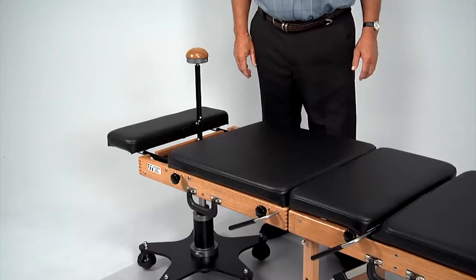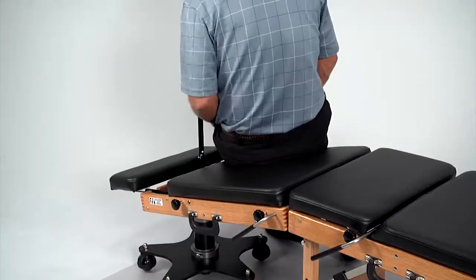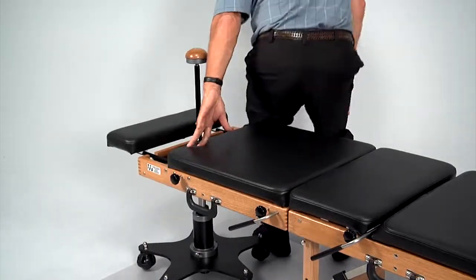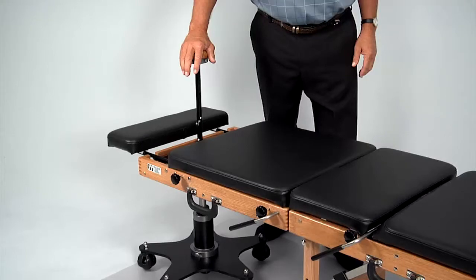If the device is left in the red position, the flexion distraction device is activated. If a patient tries to sit on the table it will flex, risking patient alarm or injury. When not in use, default to the white position.